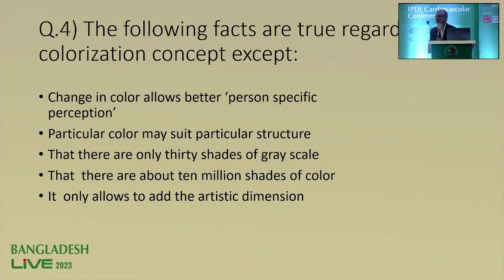So next, we move to a question on colorization. I thought it is fancy work. It just increases the beauty of the images. But I found that color really matters. To me, maybe with yellow color I can perceive the image better, but for Shakil, it may be the gray color. And it is interesting that our students are showing you that different shades make a difference in perception of the image. Let me show you.